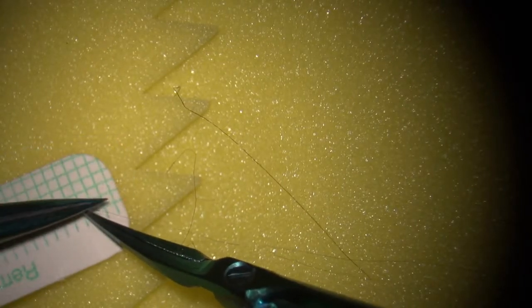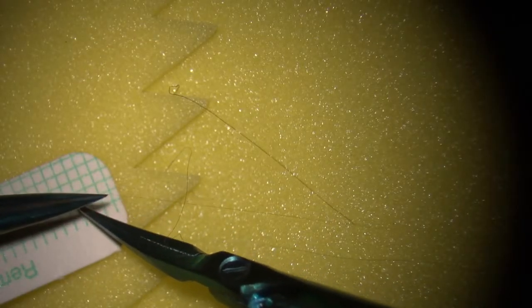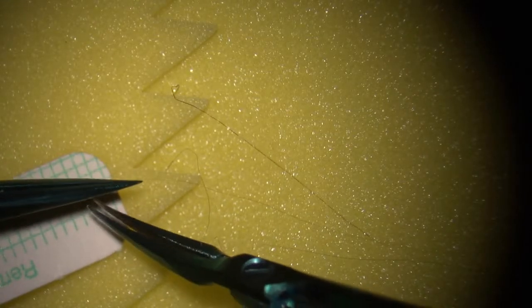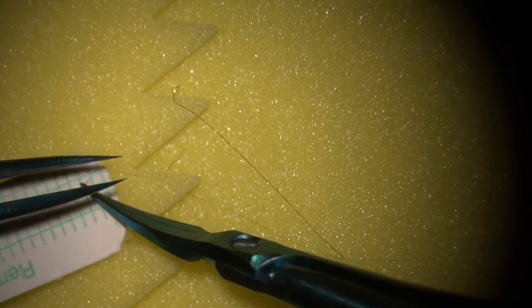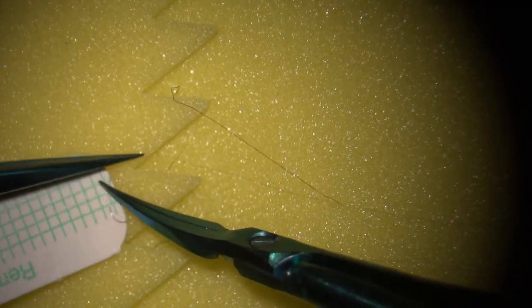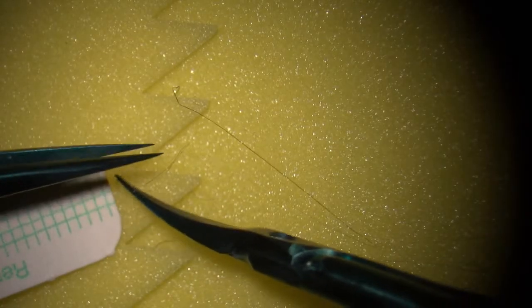Better view. How do you hold it a little bit longer? I'll hold it longer. Yeah, you have more freedom to move the needle. Try to see how I can pick it up and curve it a little bit better. Yeah, every struggle you will benefit from, because now we're training our hand, training the muscle of our hand. Do a backhand throw maybe.